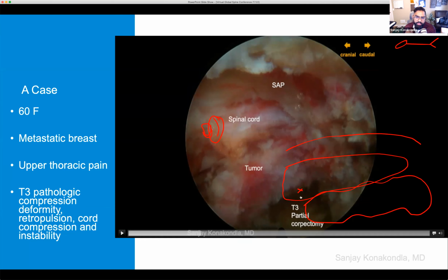And it's clearly, I would say, a lot easier and maybe even a little bit more efficient at this point, even now, to do this open, where you're having two hands in there, big, robust instruments, and really getting a lot of work done, and taking the tumor out faster so it bleeds less.